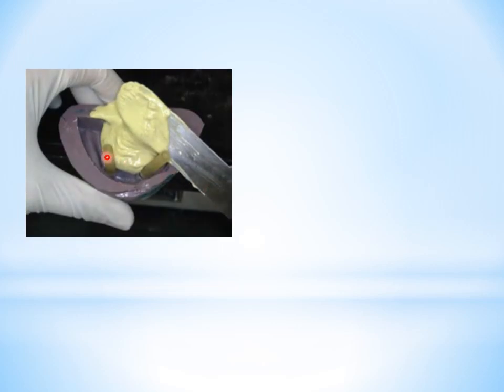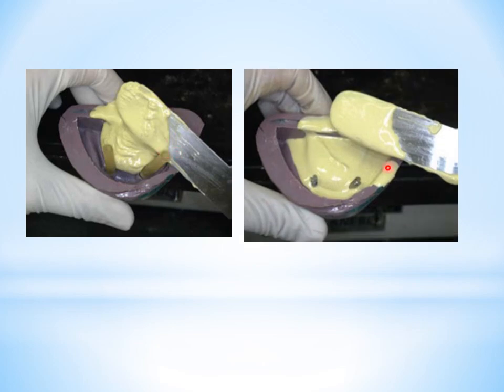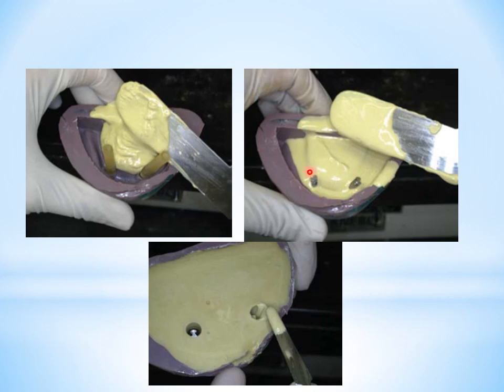Here we can see the latex tube that is put over the analog to save the space during pouring of the impression. After initial set of the material, we can remove this latex and complete the setting and pouring of the material.